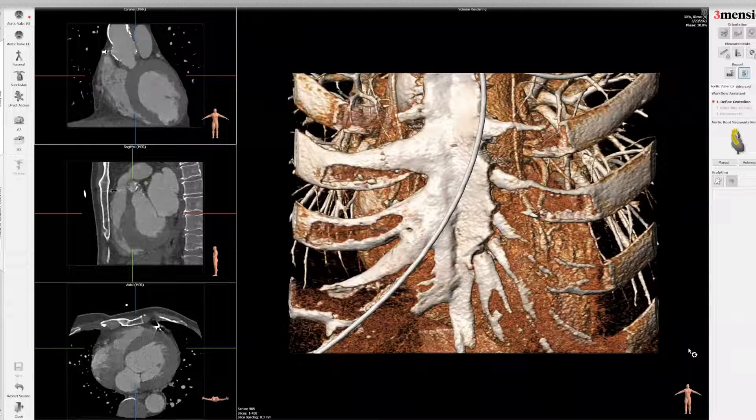Hello, today I'm going to show you a Framework workup of valve-in-valve TAVR with a calcified homograft. This is one of the more challenging cases to work out because it was a root replacement, and so there are a number of nuances to go over.